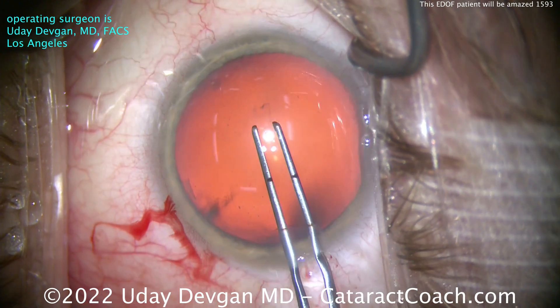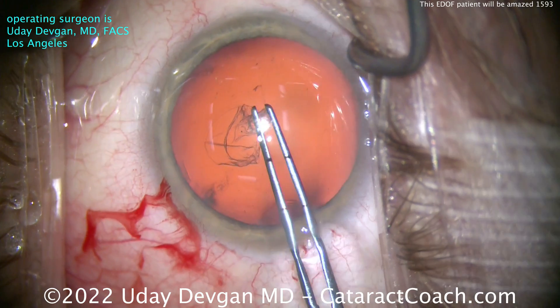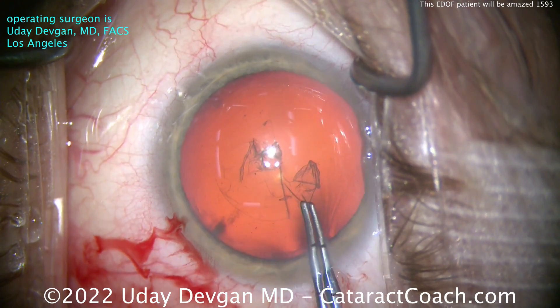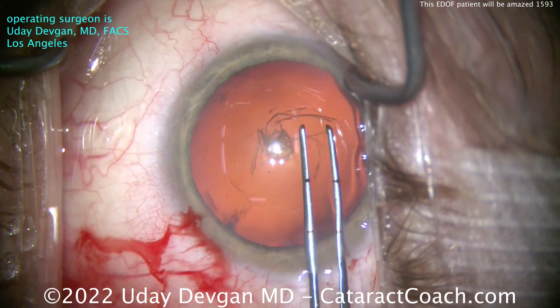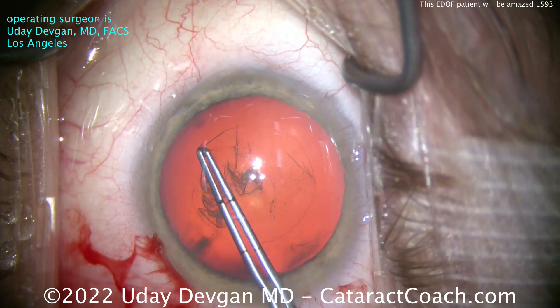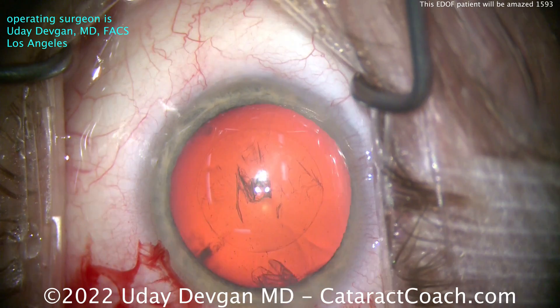Starting off, trying to poke into the capsule and get our rhexis done. Because it's a myopic eye, it's important to measure that rhexis. Using forceps here — I'm measuring, getting an idea in my mind. I don't want too big a rhexis. With a big eye, big corneal white-to-white, and big dilation, you can be fooled into making too large a rhexis if you just follow the dilation. The two marks on the forceps are two and a half millimeters and five millimeters from the tip, allowing me to create a near-perfect five-millimeter capsulorhexis. That looks great.